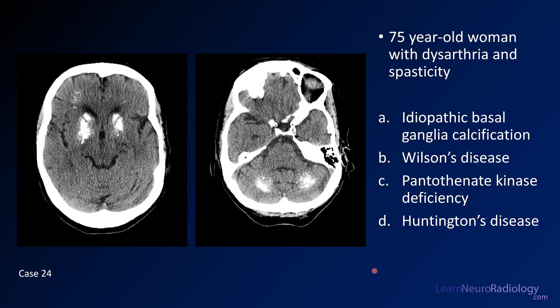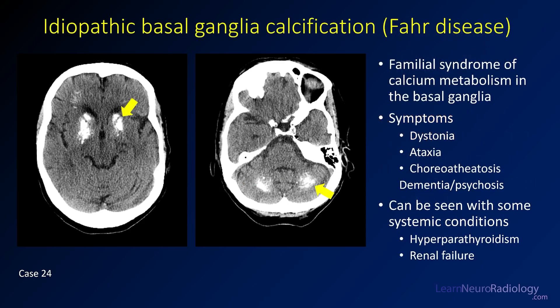Case number 24: a 75-year-old woman with dysarthria and spasticity. Two axial CT images. Choices are idiopathic basal ganglia calcification, Wilson's disease, pantothenate kinase deficiency, or Huntington's disease. The answer is idiopathic basal ganglia calcification. You see bilateral, symmetric abnormal calcification involving the corona radiata, caudate, putamen, and some posterior fossa structures. This is a condition of familial calcium accumulation predominantly in the basal ganglia — also called Fahr disease when primary. Secondary causes include renal failure or hyperparathyroidism. These patients can develop movement disorders, dementia, and psychosis.